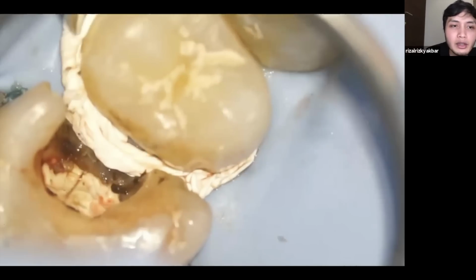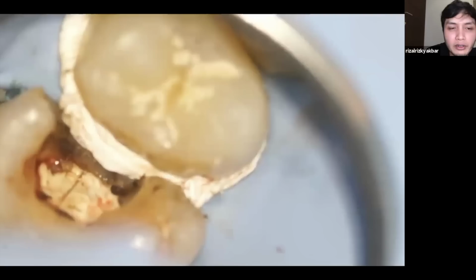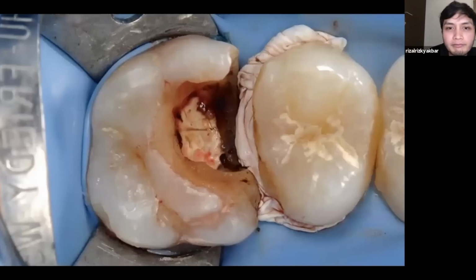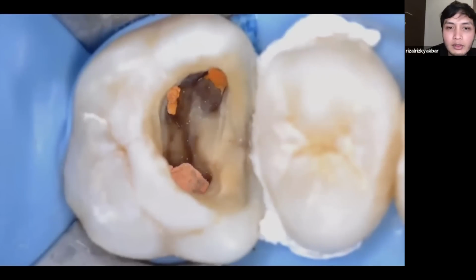Okay, after this, you can do endodontics, you can build up the proximal wall or something, because you have the comfort. There will be no saliva, there will be no blood.